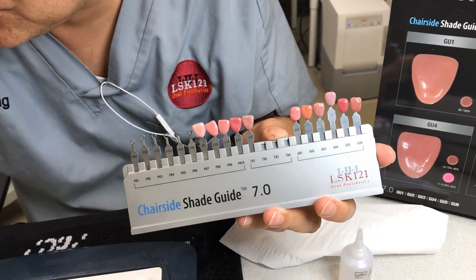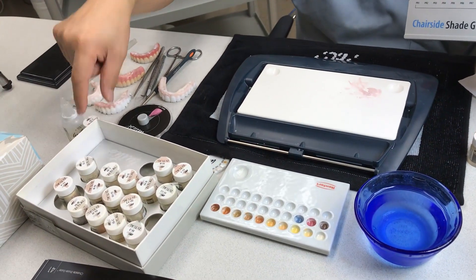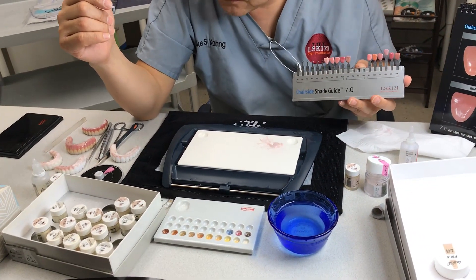So why do I do this? Because without this color, you cannot mimic the natural teeth. We call it pink aesthetic — so we cannot mimic that without it.